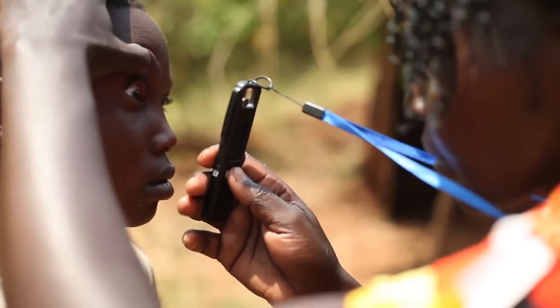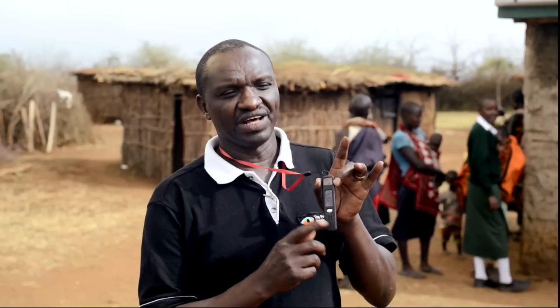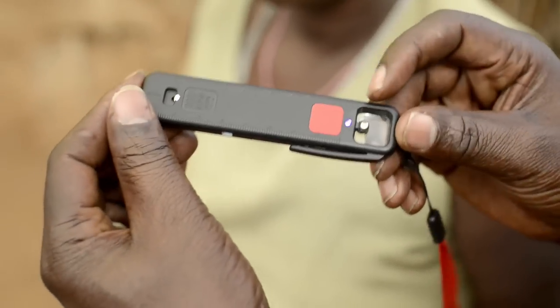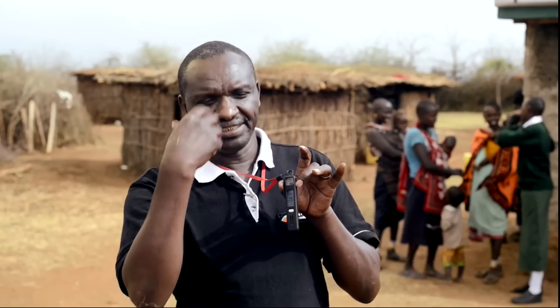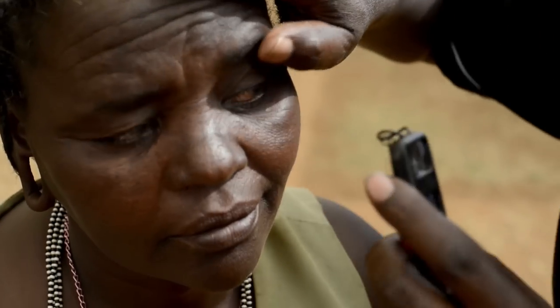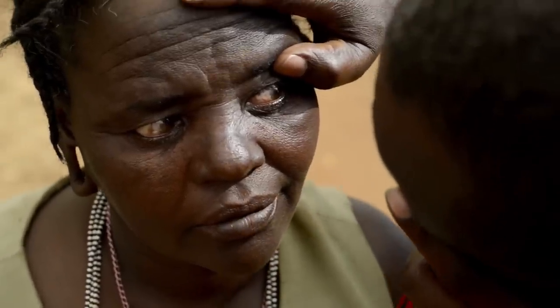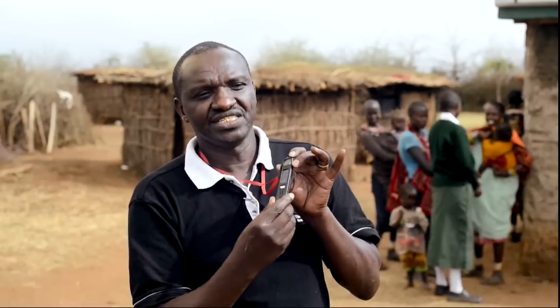I can even diagnose trachoma. Here we have the ophthalmoscope that we use to examine the fundus of the eye. It also has a loop, which we use to examine the anterior segments of the eye — including the cornea and the anterior chamber — using this equipment.